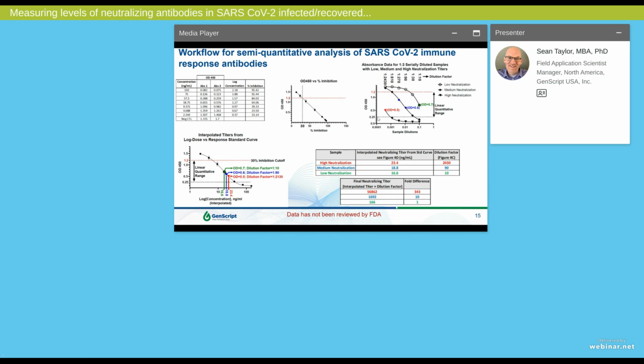So what we're looking for are data for our individual samples that fall in this region between 0.25 and 1.2. And the only way to reveal points that fall in this range is to actually dilute the individual samples as well. And we recommend that samples be diluted in a 6-point dilution series, starting from a 1 in 10 dilution in the sample buffer that comes with the kit, followed by 5 1 in 3 dilutions. So from 1 in 10 all the way down to 1 in 2430.